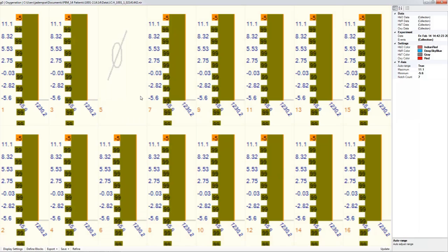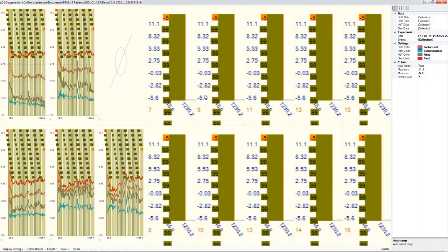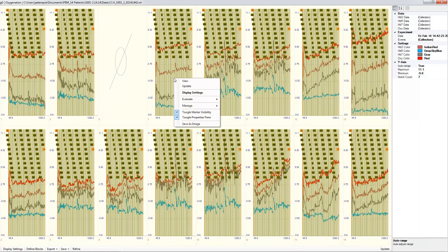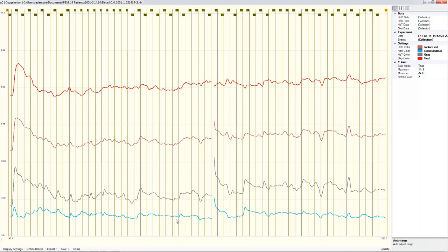Now when we maximize this, we can see because we rejected optode 5, it was giving us no data. It's marked out here. It can be a little difficult to actually start working with your data when we're seeing all eight segments. So I find it's helpful to actually right click on one of them and click view. And that's going to be easier to work with when you're laying down your markers.